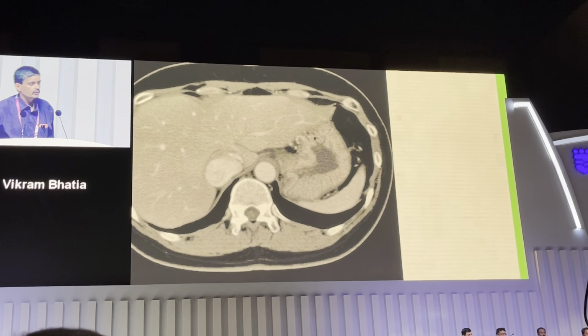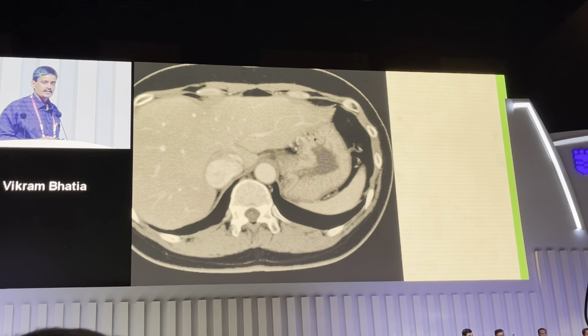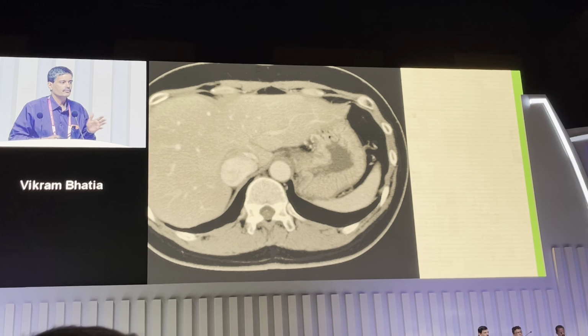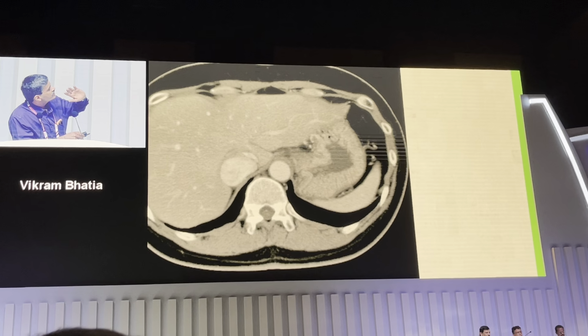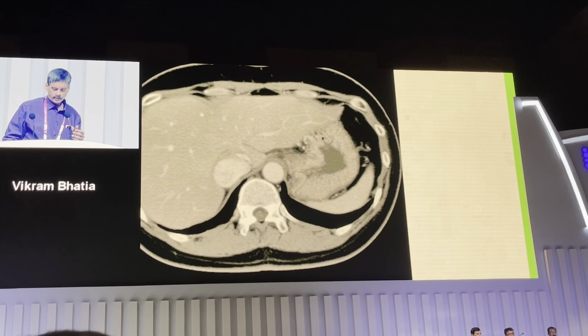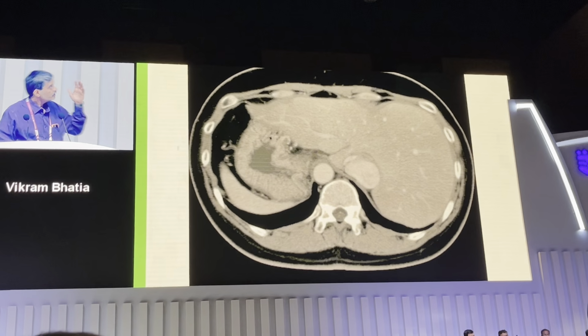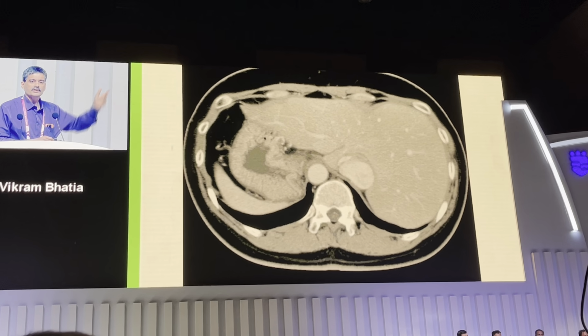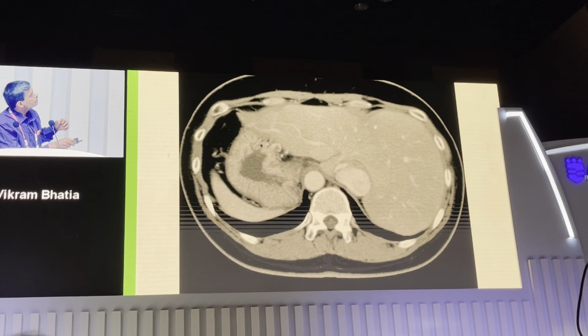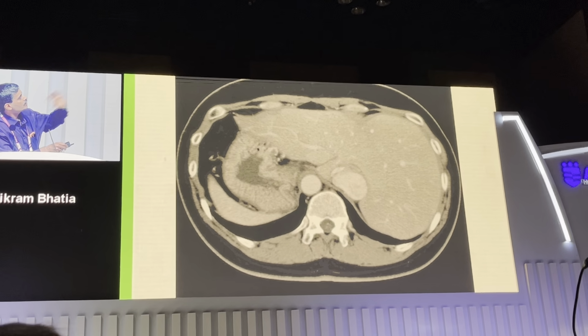Now coming on to the abdomen, if you look at a CT scan, the CT scan is displayed as if you are looking into the patient's body from below, from the patient's leg side to the head side, from below upwards. But when you do EUS, in your own mind, you have to flip the CT scan and conceptualize it like you did in the Gray's Anatomy textbook. So now you are looking into the patient from above behind.